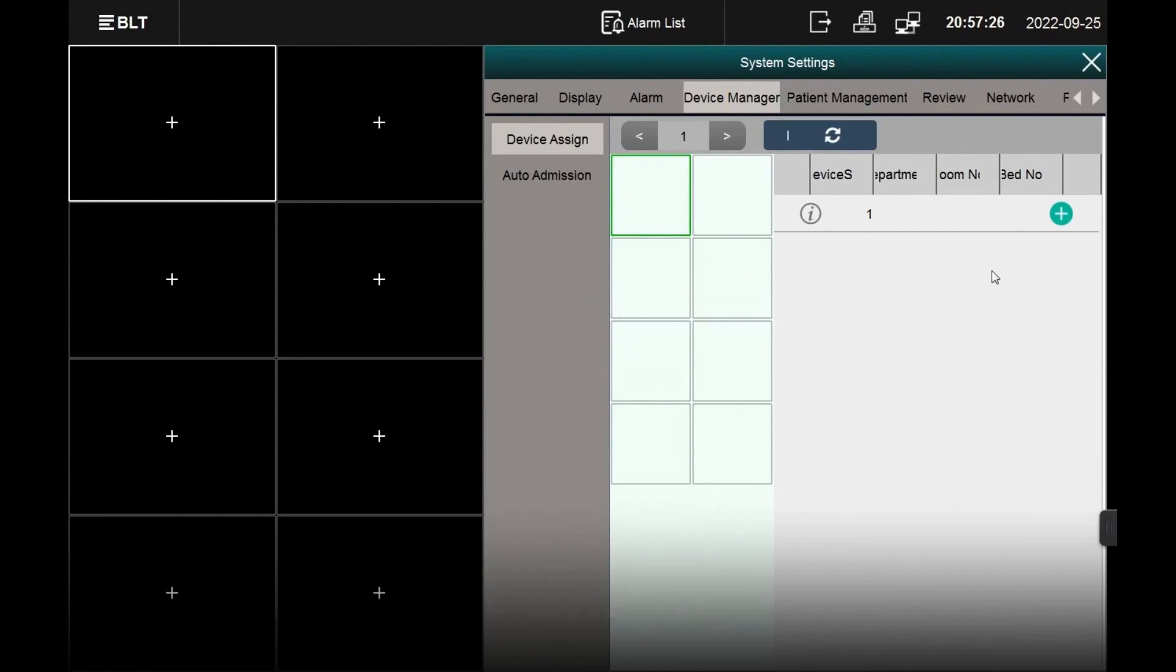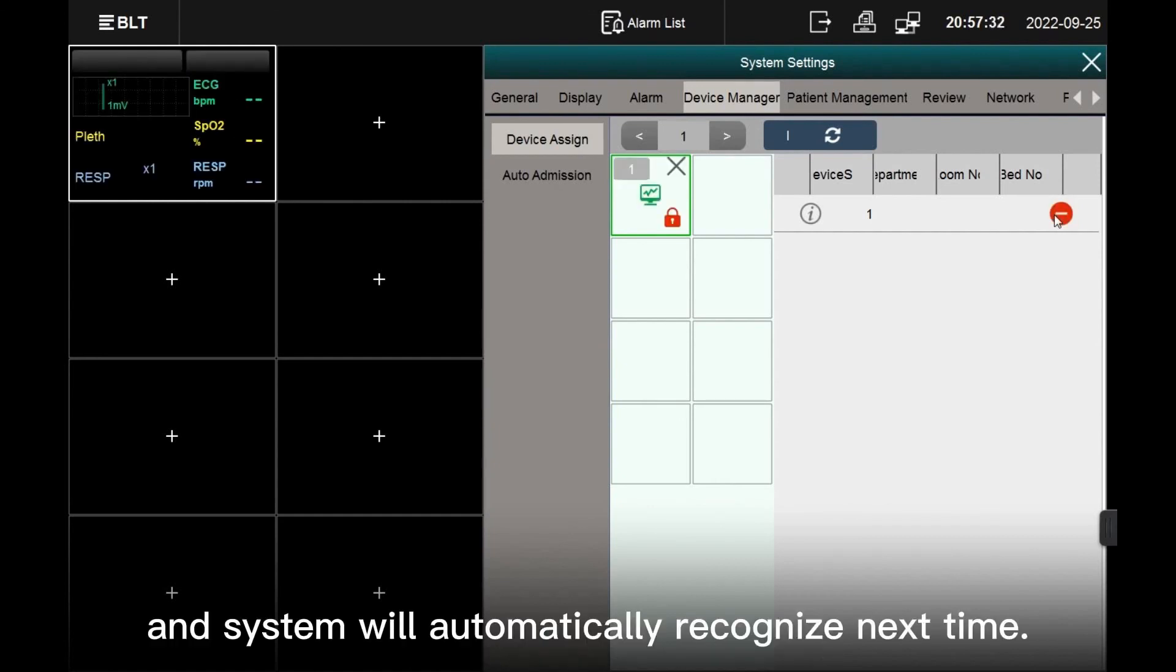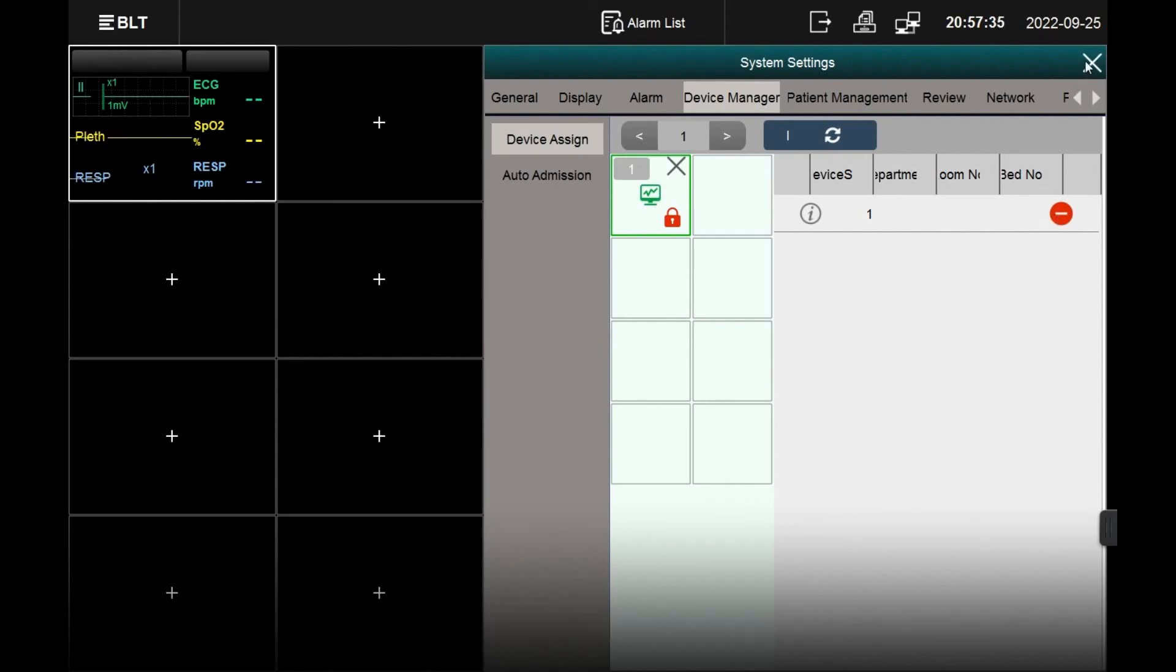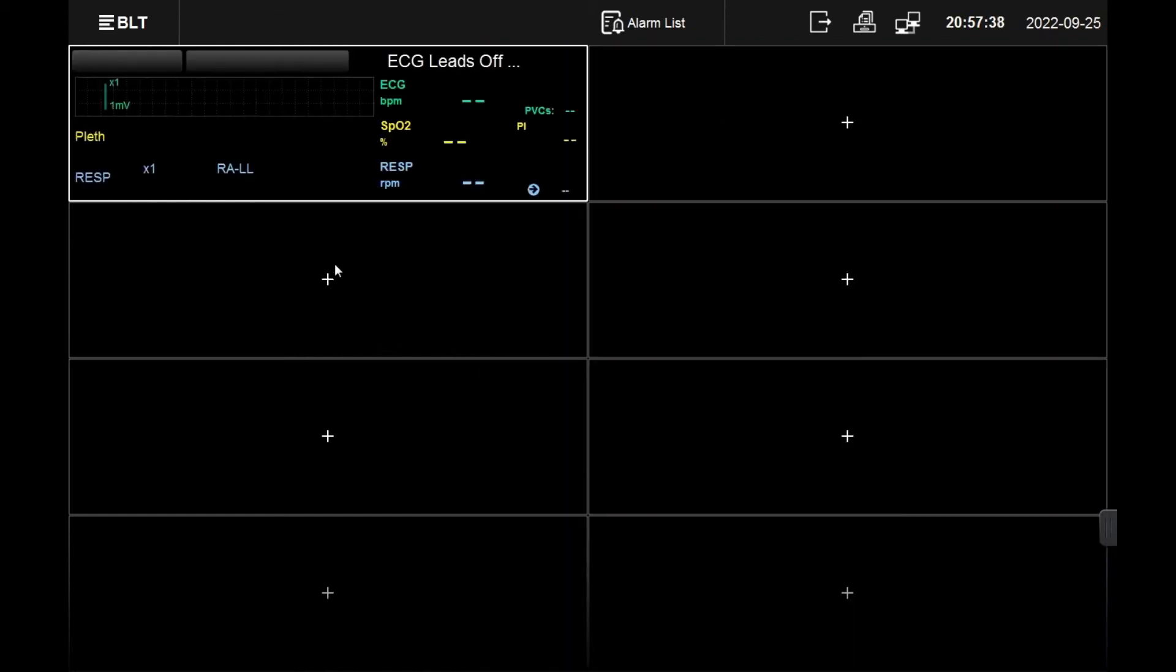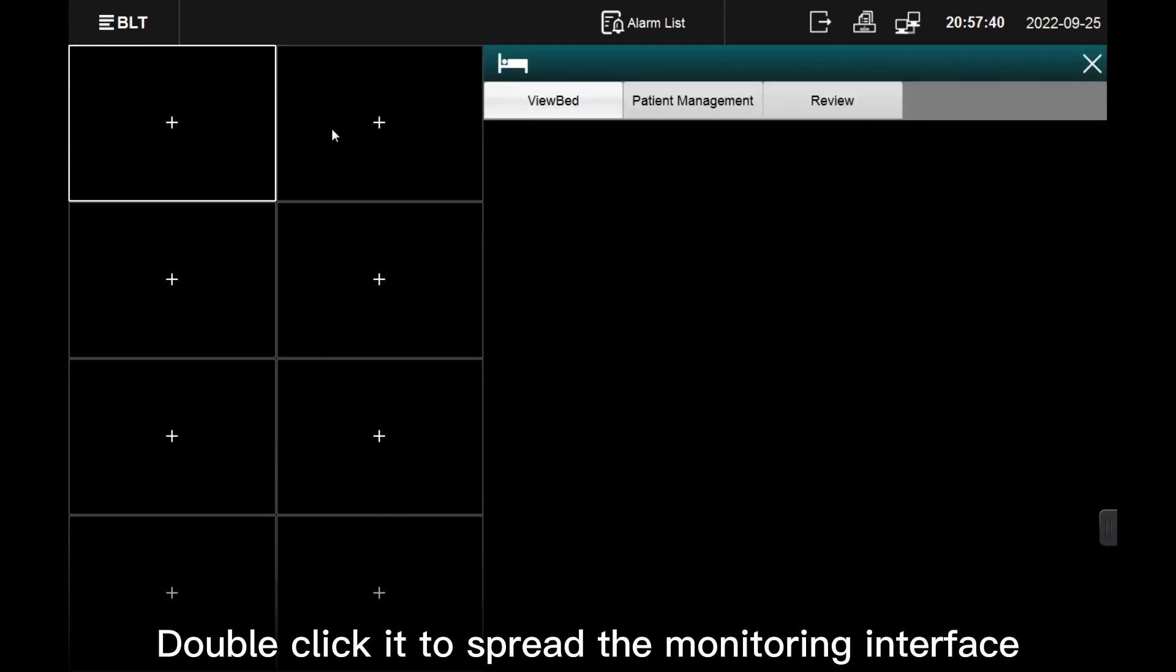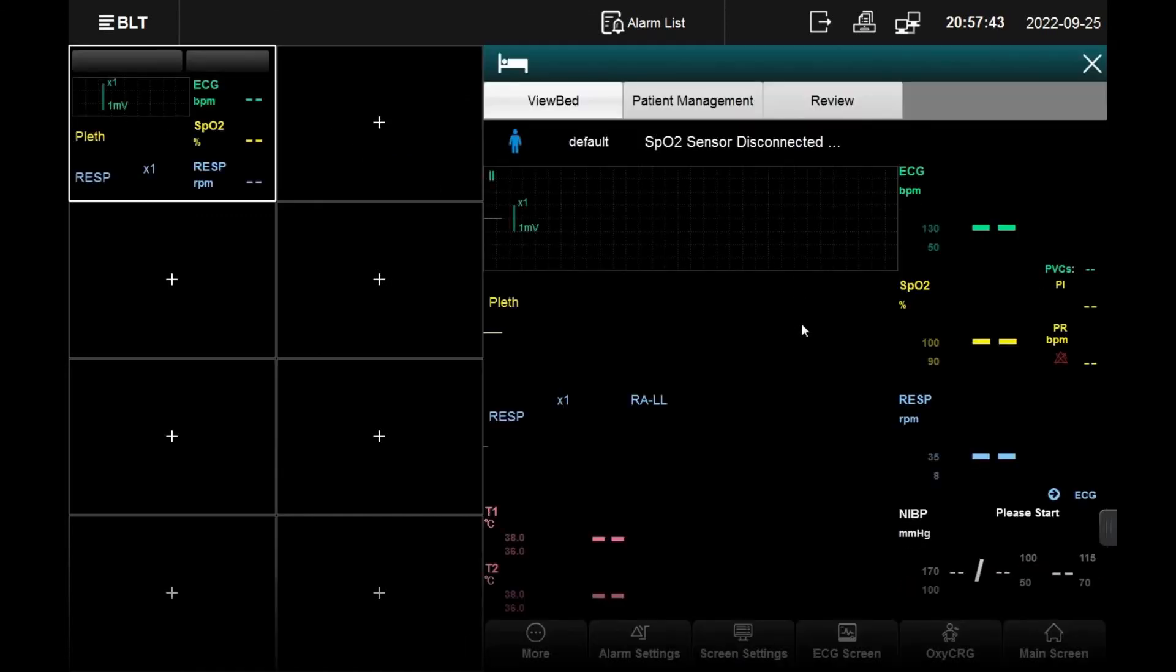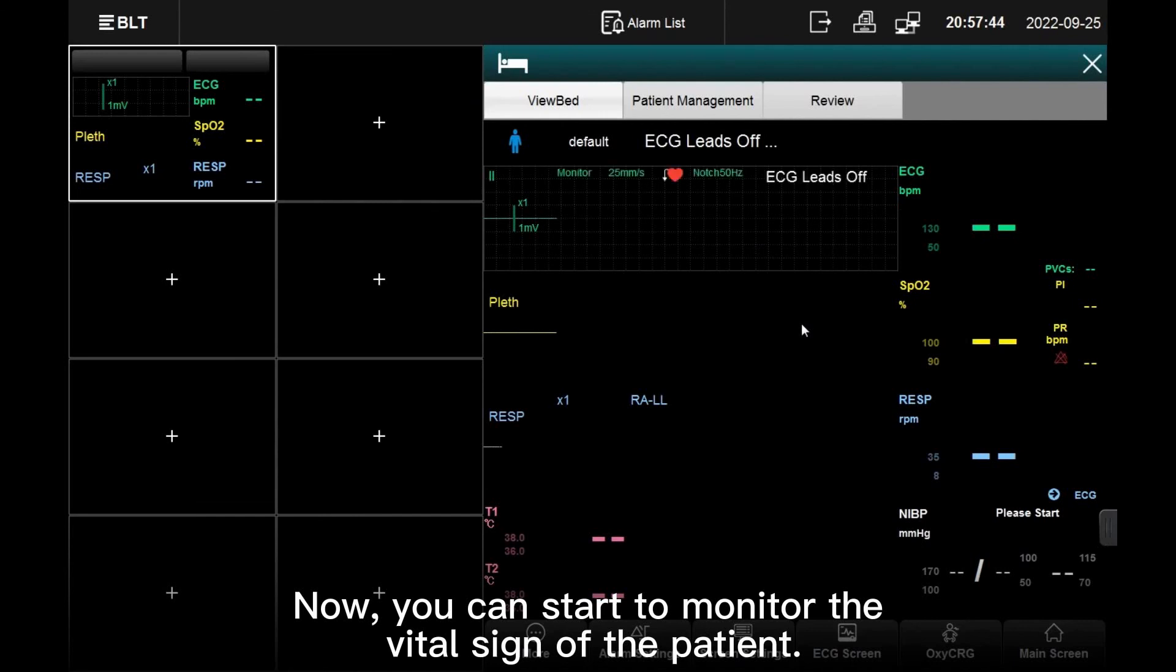Press the Plus to add the new monitor. Now it is successfully added, and the system will automatically recognize next time. Double-click it to spread the monitoring interface. Now you can start to monitor the vital sign of the patient.